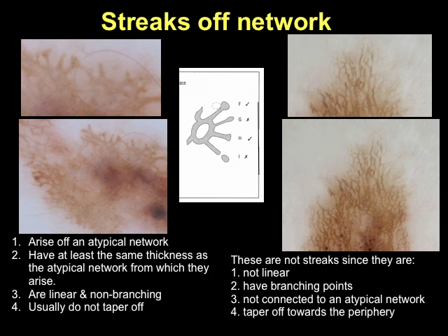Streaks of the network are depicted in the images on the left, where streaks arise from an atypical network. They have the same thickness as the atypical network, are linear and non-branching, and do not taper off towards the periphery. The image on the right is that of a reticular nevus. The lines seen here are not streaks since they are not linear, have branching points, are not connected to an atypical network, and taper off towards the periphery.